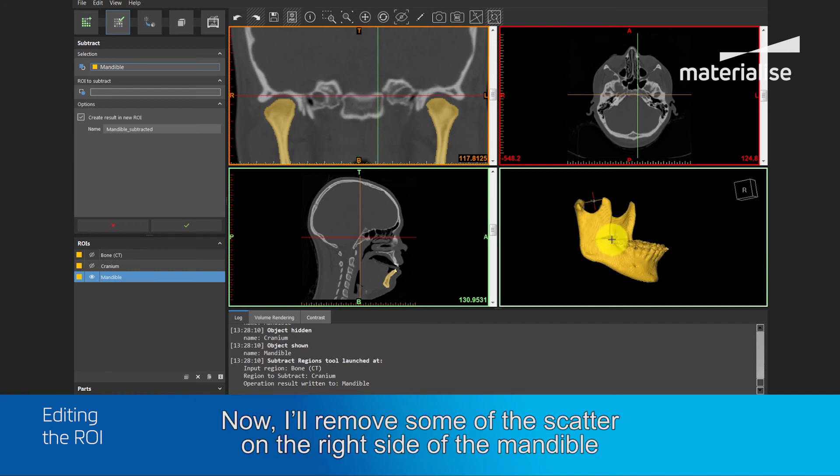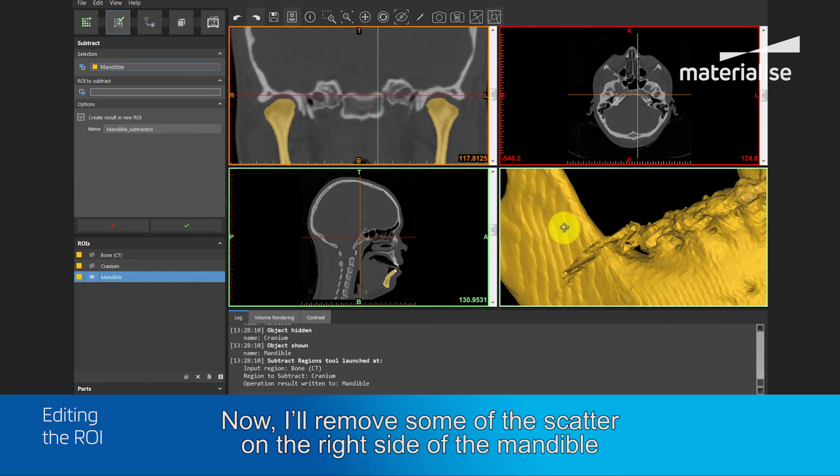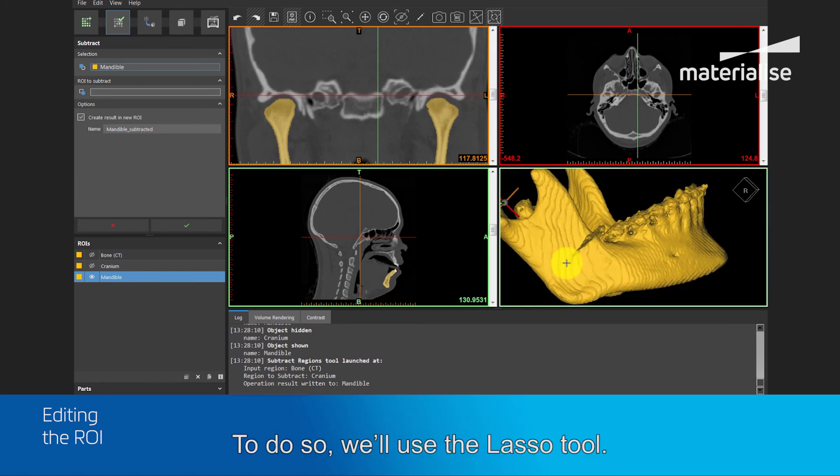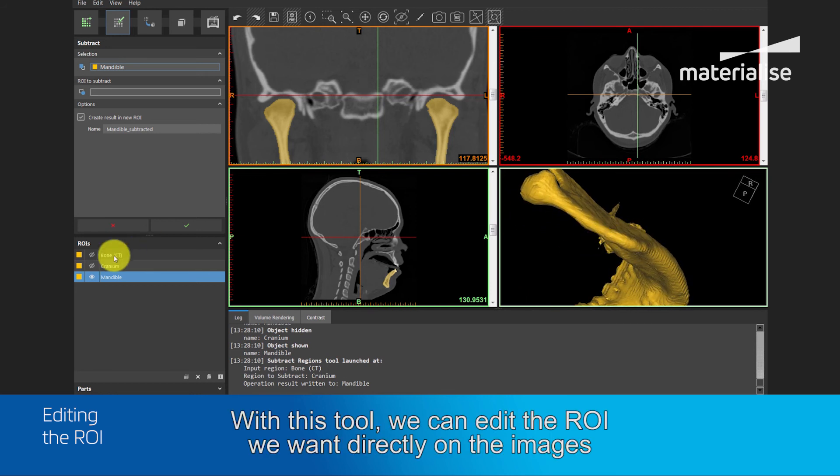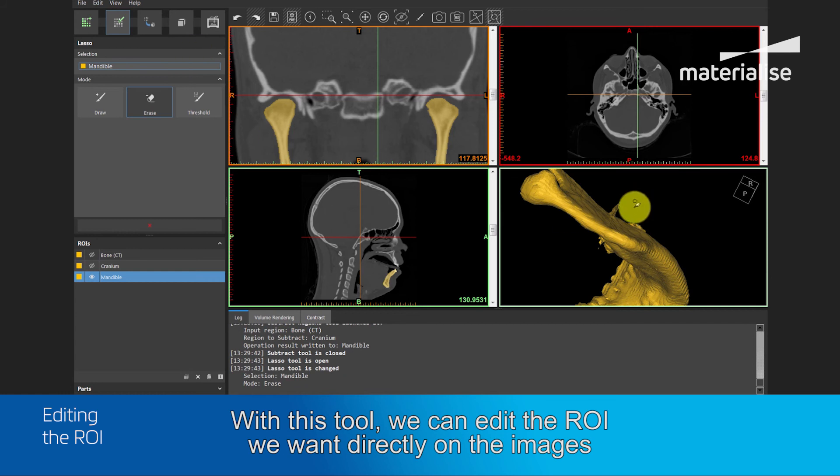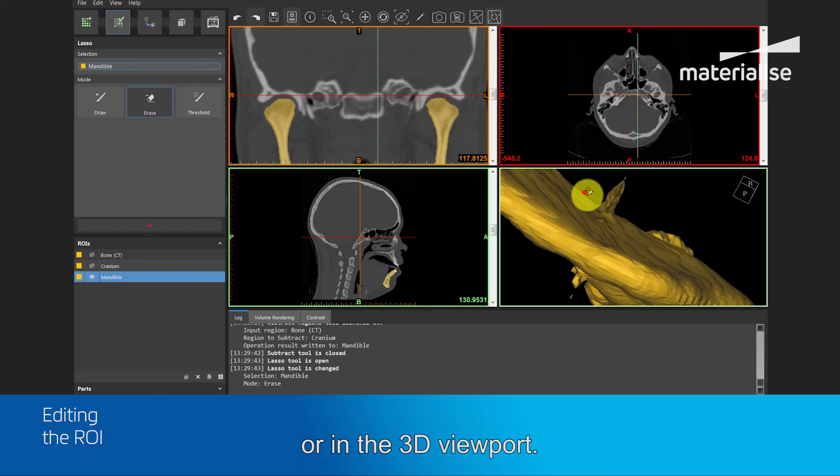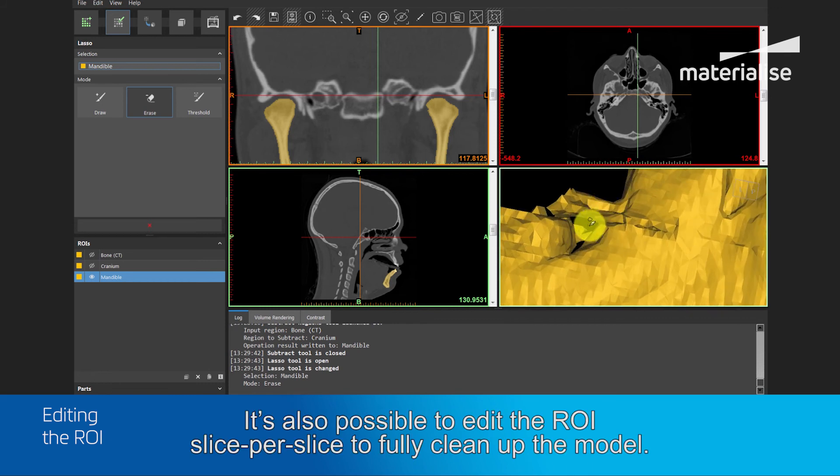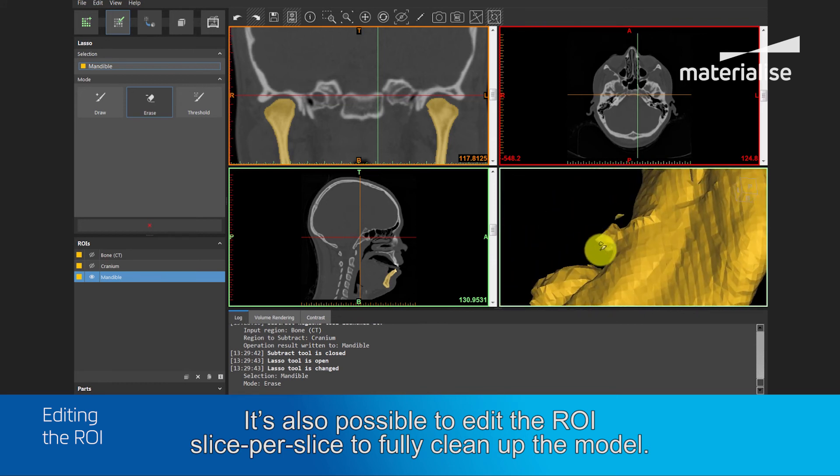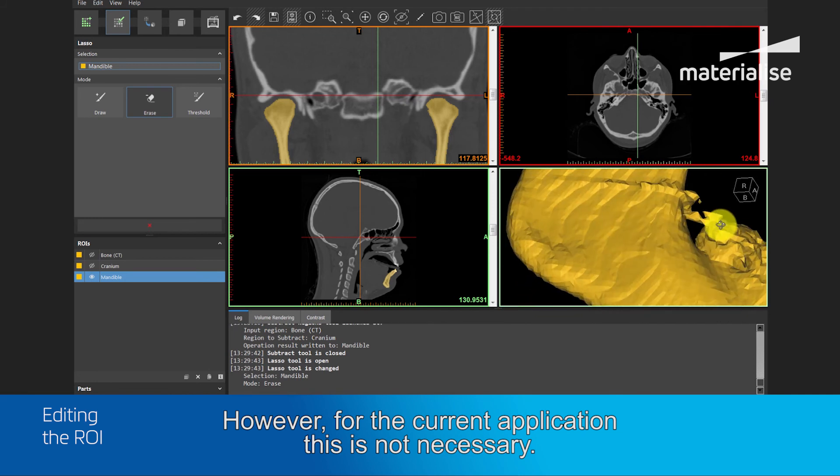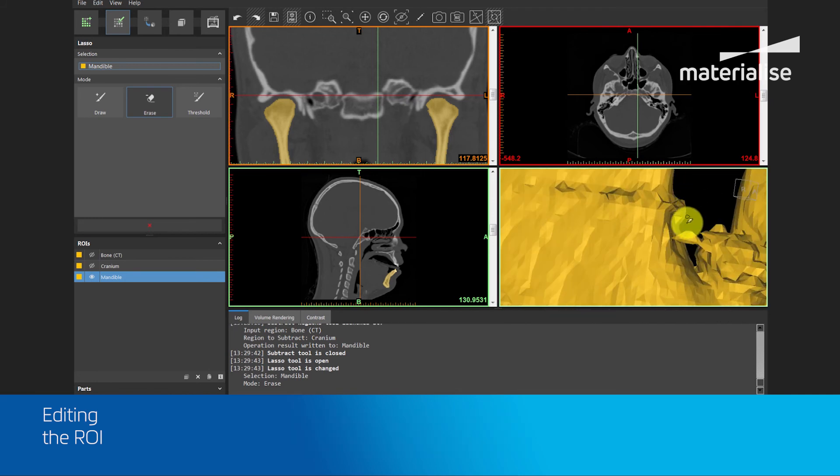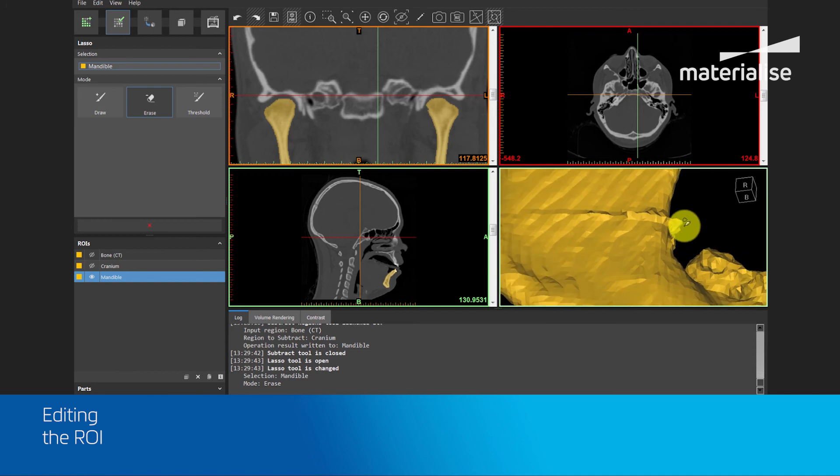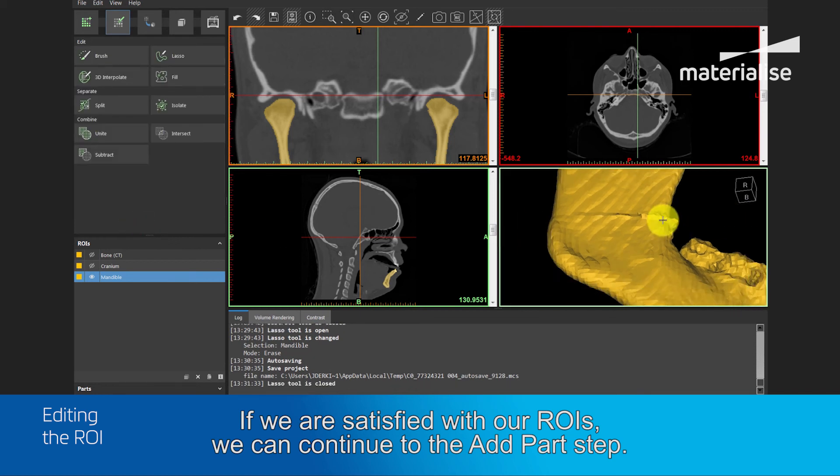Now I will remove some of the scatter on the right side of the mandible, near the second molar. To do so, we will use the lasso tool. With this tool, we can edit the ROI we want directly, on the images or in the 3D viewport. It is also possible to edit the region of interest slice-per-slice to fully clean up the model. However, for the current application, this is not necessary.